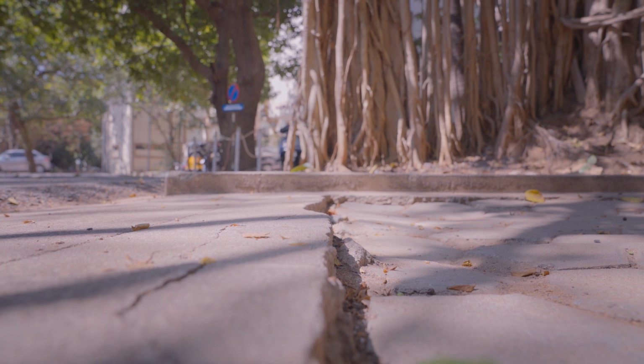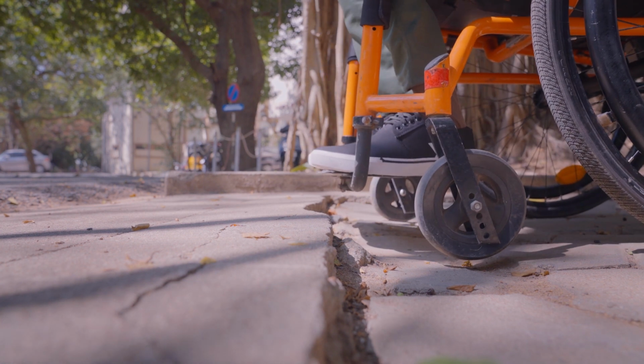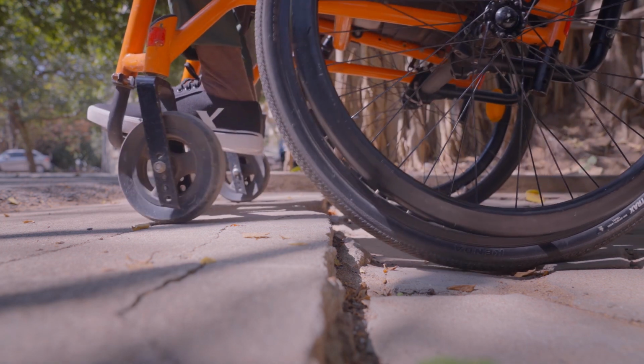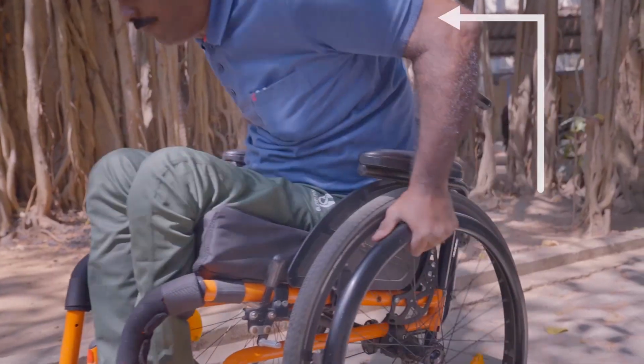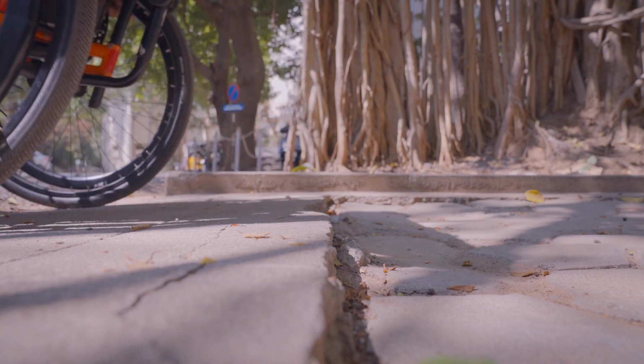Moving up a small kerb independently by popping casters. To move up the kerb, pop the casters, push the rear wheels forward and drop the casters gently on the kerb. Now push the rear wheels closer to the kerb. As it touches the kerb, lean forward and push with a sudden force to go up the kerb.